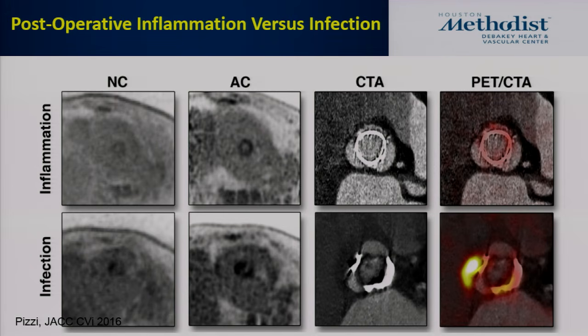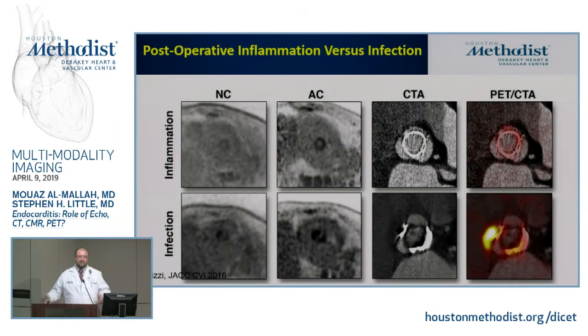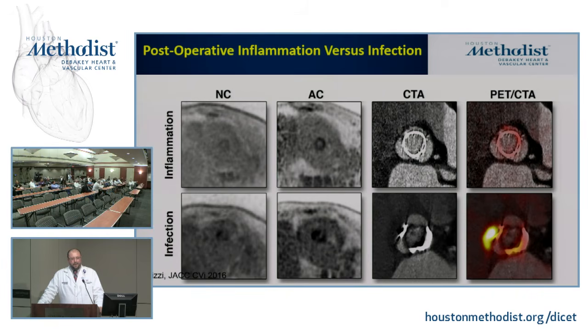It depends also on the patient. But maybe for our protocol, if the suspicion is endocarditis, we can ask them to go down a little bit to the abdomen and look. It is kind of an embolic tiebreaker. I actually had a case a week and a half ago, a huge splenic infarct. Of course, it was reported out as that, and he had a vegetation on the valve. That's extremely important. Absolutely.